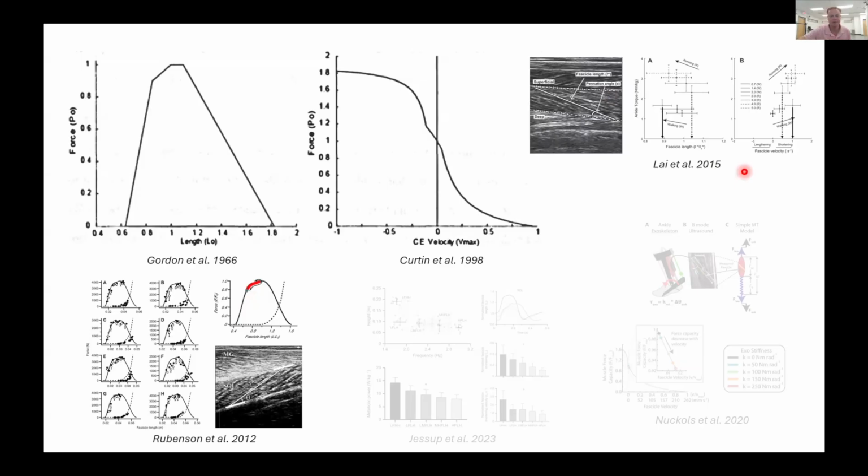And again, with ultrasound over the soleus muscle, and with an estimate of the optimal fascicle length of soleus, they were able to show that the preferred speed to transition from walking, which would be this dark line here, to then running, this dashed line here, keeps the muscle operating near to optimal fascicle lengths, as indicated by this fascicle length equals 1 or L naught. And it also was able to keep muscles operating at shorter velocities as well.